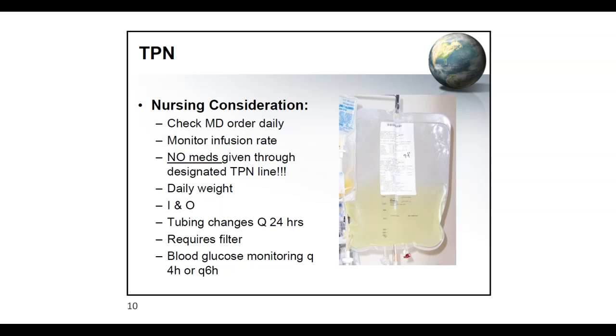If you are giving TPN, please do not give anything with that line. So don't push, let's say, even if it's something as simple as pantoprazole or Protonix, right? This shouldn't be used to administer other medication. Do not make this your primary and hang a piggyback. So this should be given on its own. The only thing that you can sort of mix with this would be your lipids. But other than that, you don't mix any other medication with this.